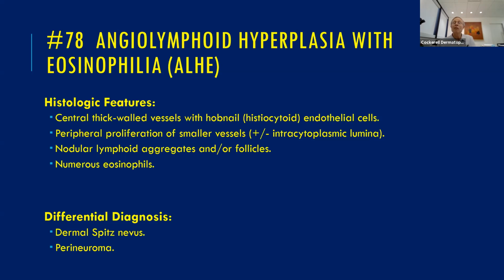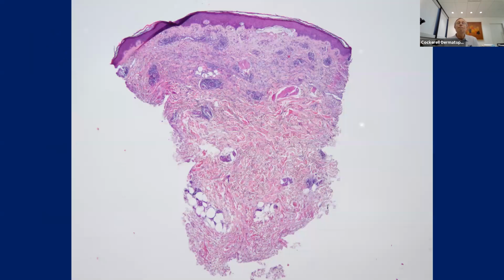Now, there's another disease that you have to make sure that you don't confuse with this, called Kitamura's disease. That's more of an epidermal hyperpigmented process, as I recall. So it's a different deal than this, but Kimura's is the one that you want to make sure that you don't confuse with it clinically. Okay, let's look at the next one.